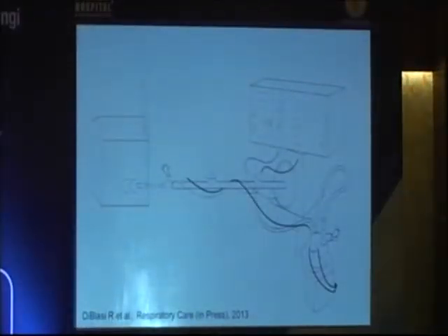So we had basically 4 testing conditions. We wanted to evaluate drug delivery proximally, as close to the endotracheal tube as possible, in the inspiratory limb, and back at the ventilator. Remember that this is proximal, this is distal during conventional ventilation. This is going to change your practice a little bit, I think, not because my research is good, but because no one's done it before. Okay. So here's high-frequency oscillatory ventilation. Remember I mentioned that we wanted to test the hypothesis that there's differences? Well, you have to test that nebulizer in every available location that someone can place it. So we placed the nebulizer close to the patient and then back here at the humidifier.